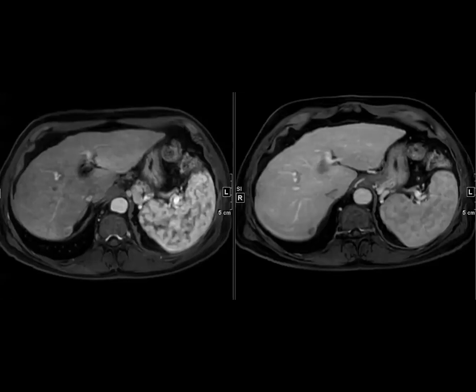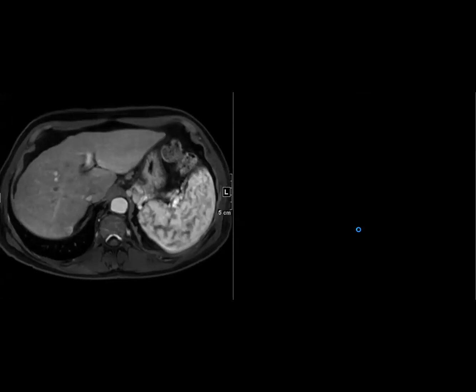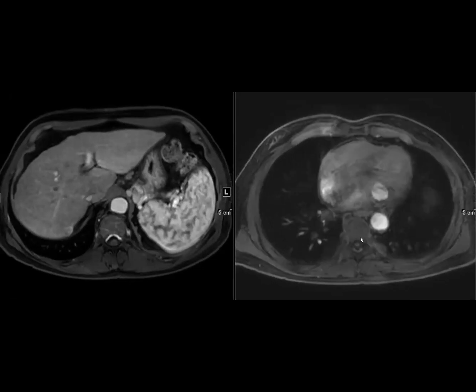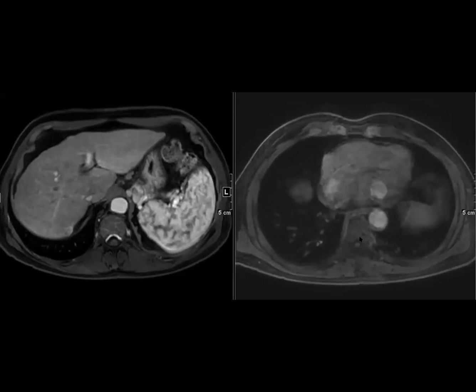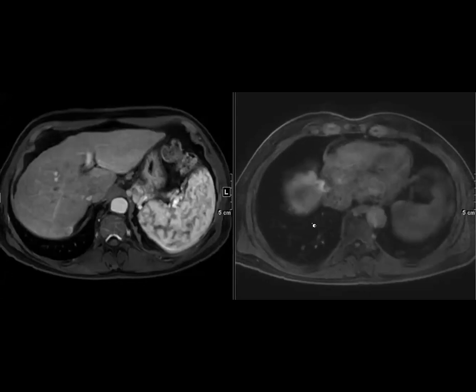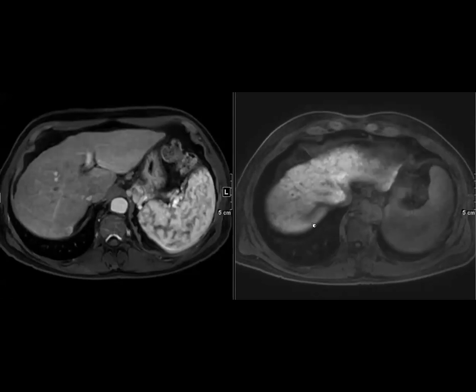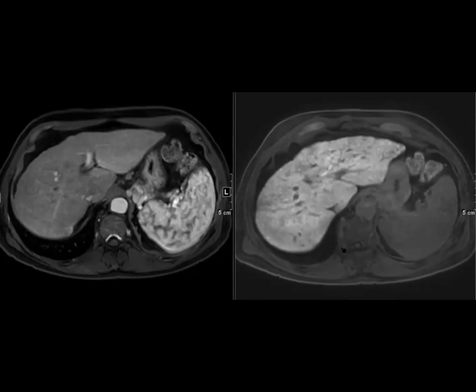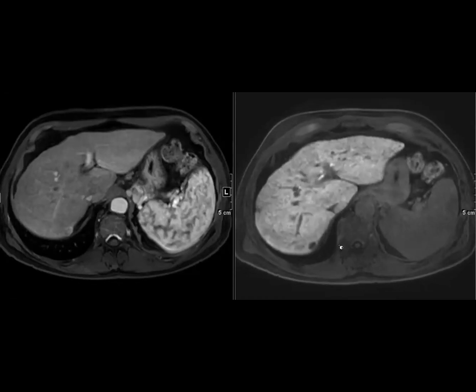It looks like rim enhancement, not non-rim enhancement. Right. Gitanjali is saying LR-M because of the rim enhancement, and Rupa is asking if this is an EOVIST scan too. This actually is EOVIST, although I'm not showing you the EOVIST phase. I think I'm on board with it being more of a rim enhancing lesion. So you guys are more astute, but this was read as LI-RADS 5. There was no other, this is the EOVIST phase. So this was read as a LI-RADS 5.